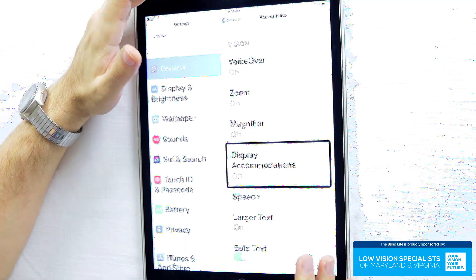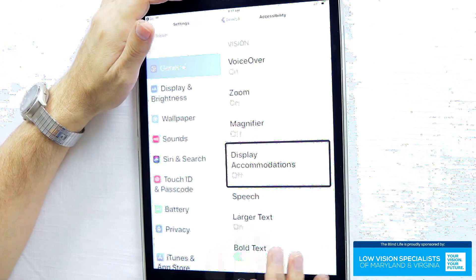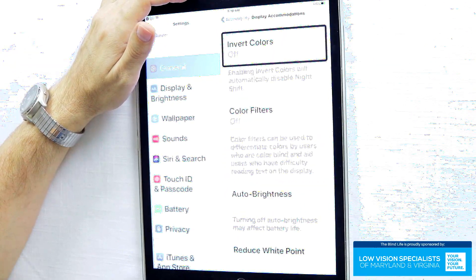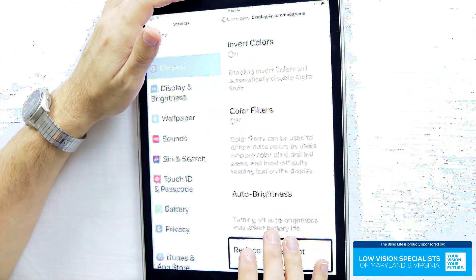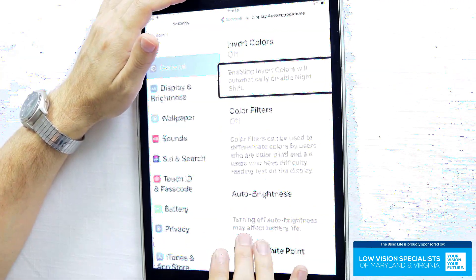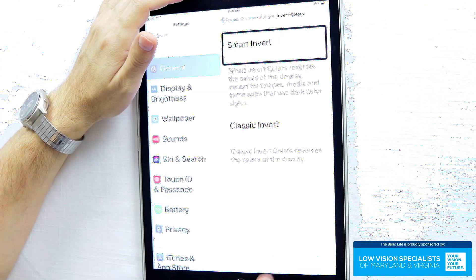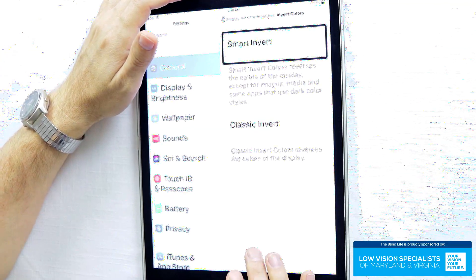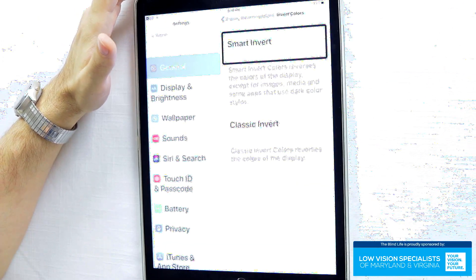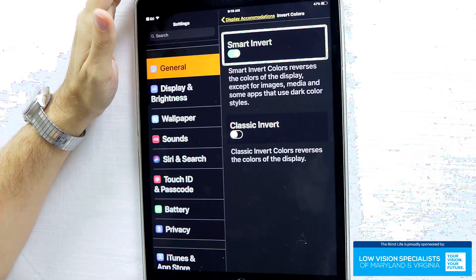Now for some people, they're going to want the screen inverted — they want the black background with light colored text. If you are one of those people, you're going to go into display accommodations and select invert colors. There are two versions in here: smart invert and classic invert. Smart invert will invert the background but tries to not invert photos and your icons on your home screen. It does a pretty good job. If you want the inverted screen, I would recommend the smart invert.